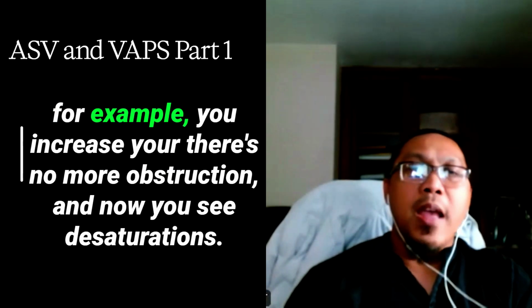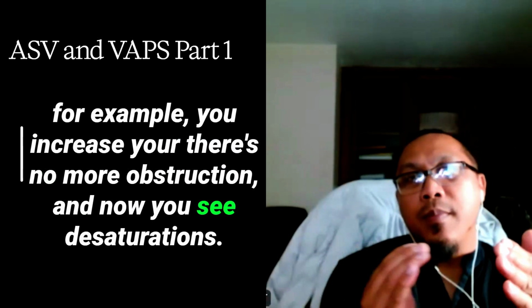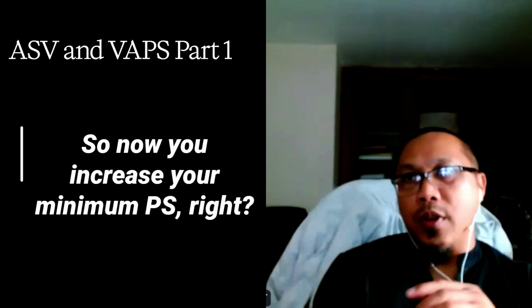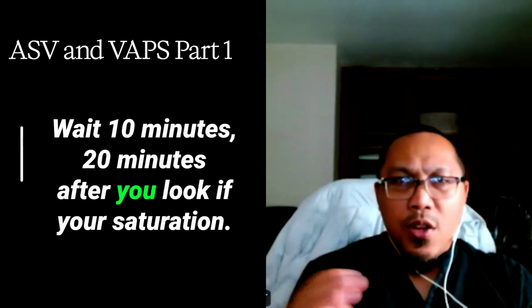Okay. For example, there's no more obstruction, and now you see desaturations. So now you increase your minimum pressure support, right? Wait 10 minutes, 20 minutes, then look.